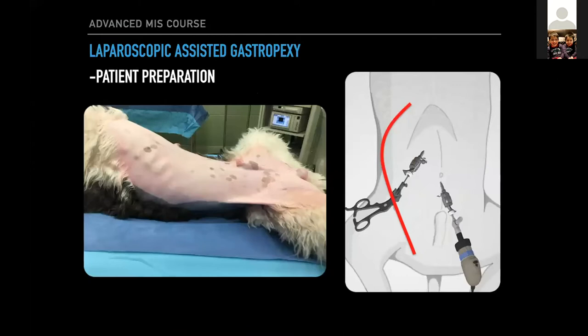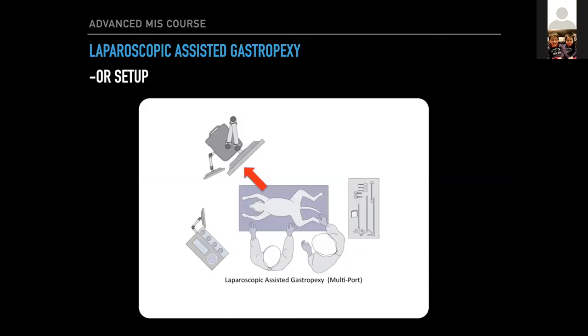Prepping these dogs is the same as for a two-port ovorectomy. You want to be a little wider on the right-hand side because your paramedian port is going to be fairly lateral — you can't just drape the linea and that's it. OR setup is nothing fancy, similar to ovorectomy. The monitor can stay in front of you off toward the head. Just don't connect your top drape to the back instrument table — gives you the opportunity to walk around as needed.